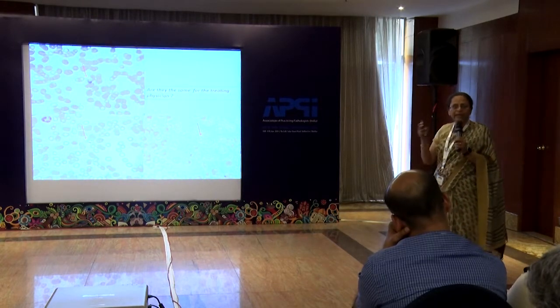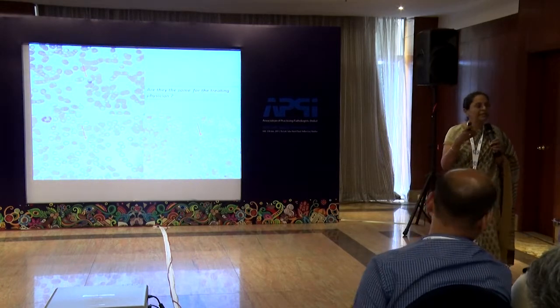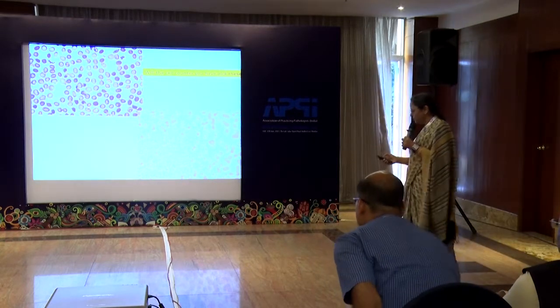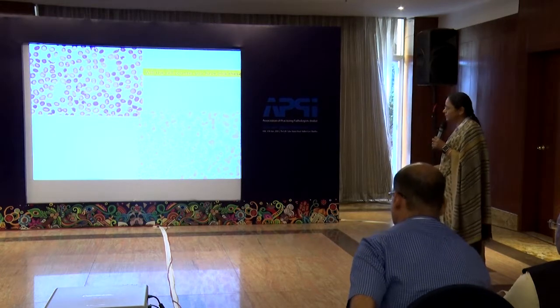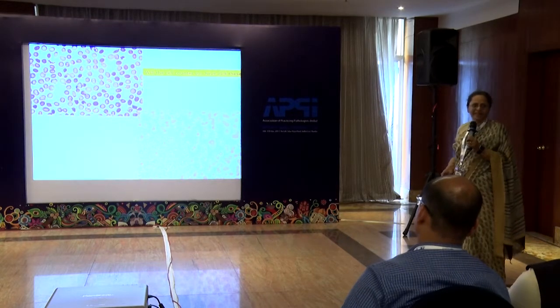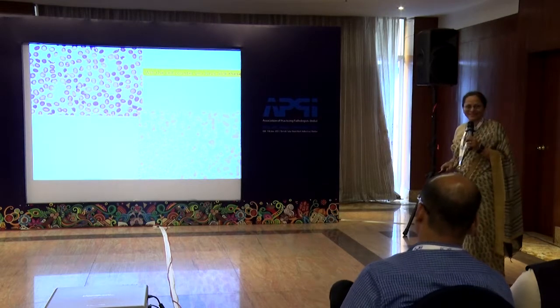So the entire clinical prognosis, the clinical management will be different. Now, can your cell counter tell you the difference between these kind of abnormal red cells and these kind? Now, who can tell me what these are and what these are? Anybody? Anybody who gets up should offer to also tell.